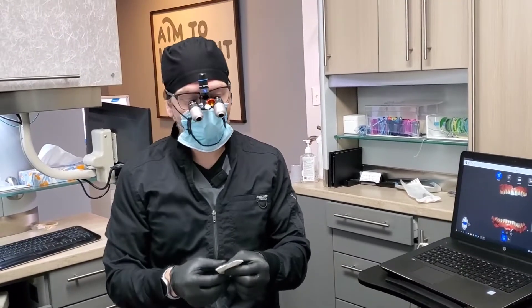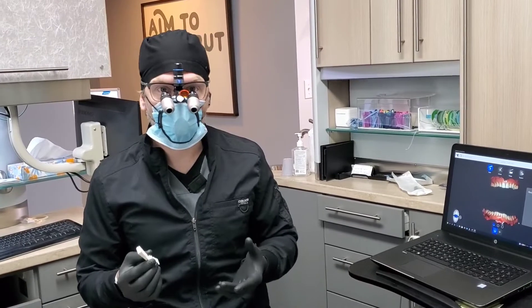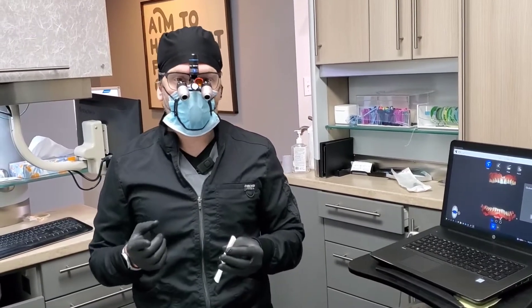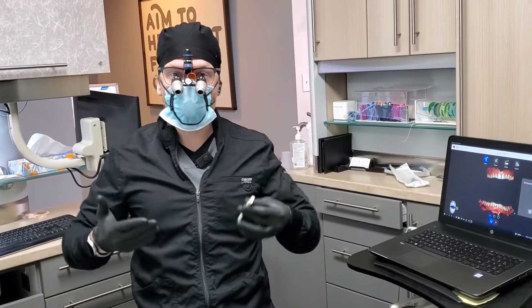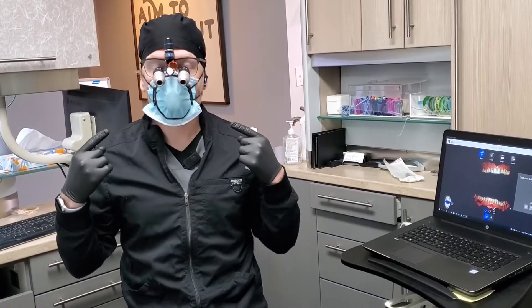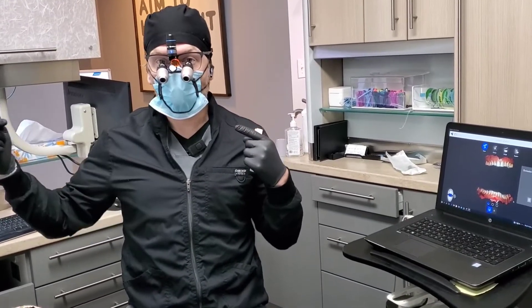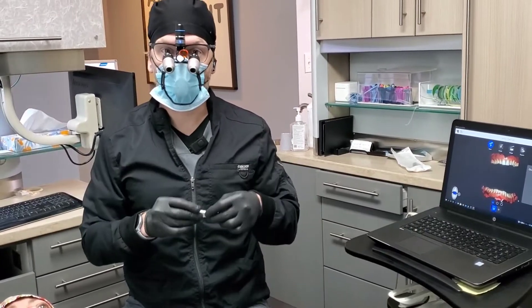So I'm going to be using a leaf gauge. A leaf gauge just allows us to open the bite up however much we want. Keep in mind, for the full arch guard — if it's going to extend full arch — we need at least two millimeters, maybe a millimeter and a half to two millimeters between the posterior teeth. And the rule of thumb is, whatever you need in the back, you need twice that in the anterior, basically as far as how much to open it.